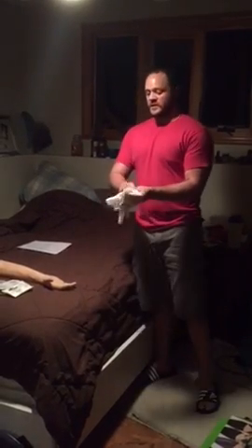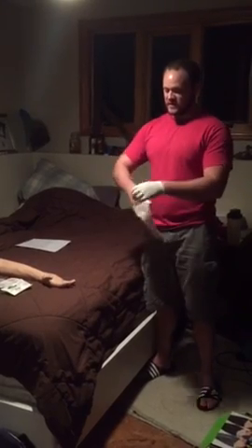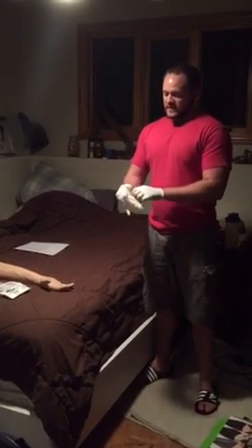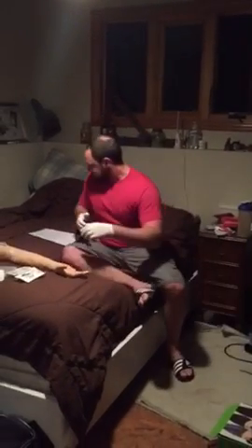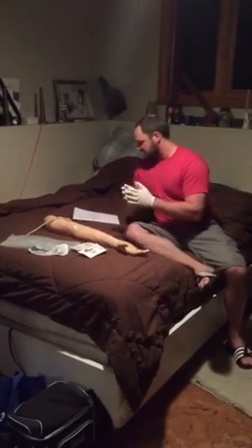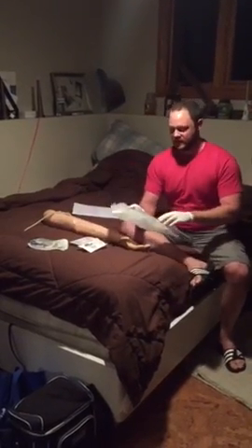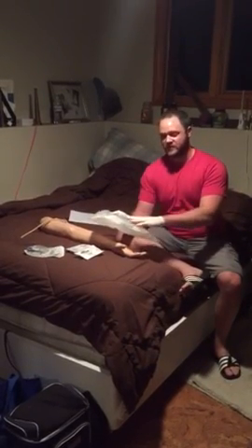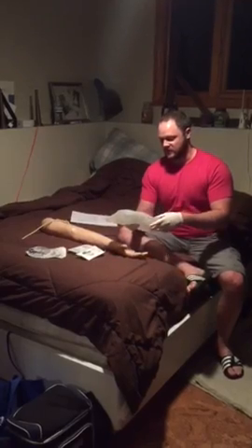Second, we're going to take our proper BSI, or body substance isolation, which in this case is gloves. And I really should be wearing goggles, but I don't have a pair. So, the third step, we're going to check the fluid. You always want to make sure at the beginning of your shift that you do not have any expired fluid. Make sure it's not cloudy or hazy or starting to look thick.